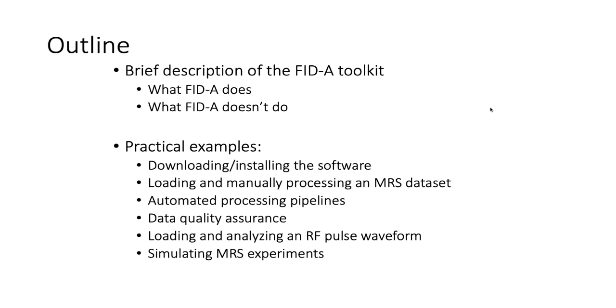So first, a brief outline of the talk. I'm going to start by giving an introduction to FID-A and what it does and what it doesn't do. And then I'm just going to walk through some practical examples of how to use FID-A. So I'll talk about how to download and install the software, how to process MRS data, how to do data quality assurance in FID-A, and then a little bit about how to use the RF pulse analysis tools. And lastly, I'll talk about how to simulate MR spectroscopy experiments in FID-A.